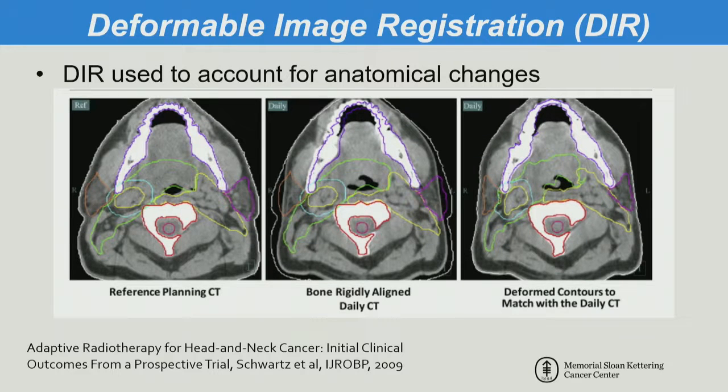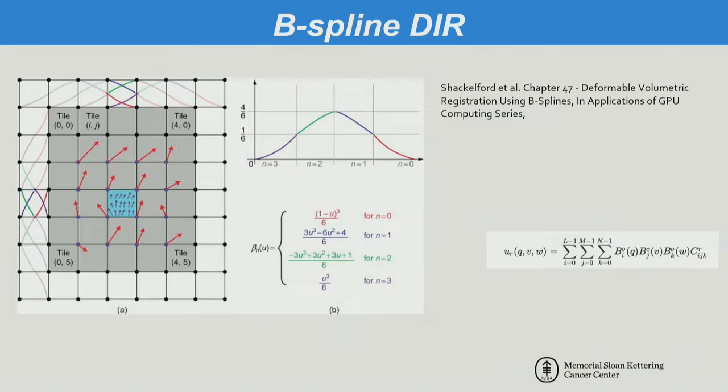Deformable image registration is really used when none of those really work, and that really corresponds or fits many of the applications that we have in radiotherapy. Changes in anatomy, weight loss, tumor response or tumor growth, for example, different position of the patient from one image to the other one, different breathing. So for that, we use other methods like B-spline deformable image registration.